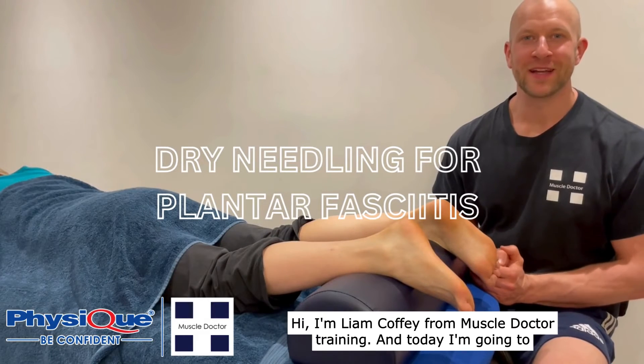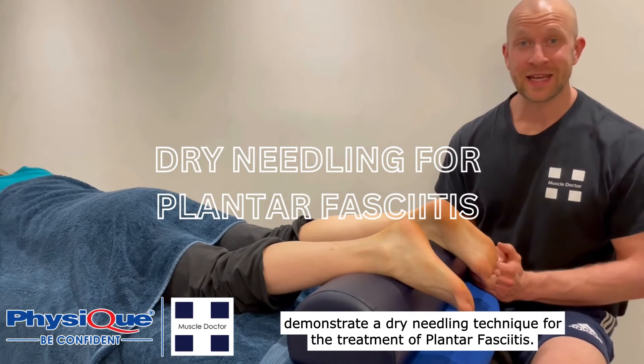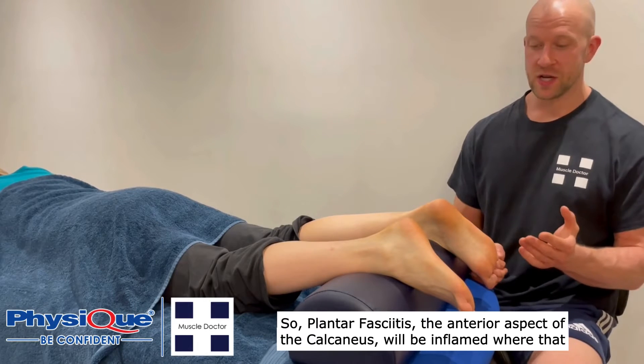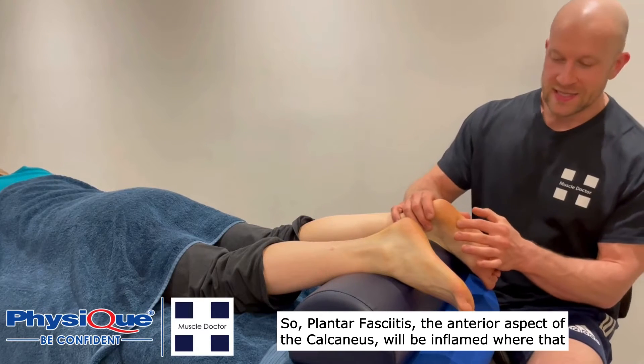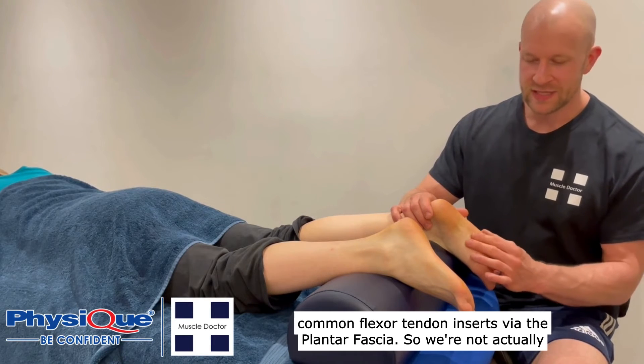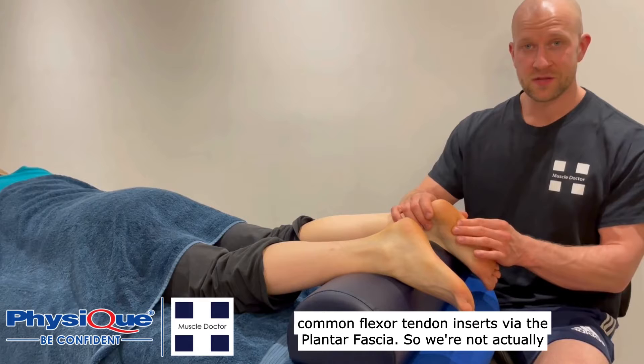Hi, I'm Liam Coffey from Muscle Doctor Training and today I'm going to demonstrate a dry needling technique for the treatment of plantar fasciitis. With plantar fasciitis, the anterior aspect of the calcaneus will be inflamed where that common flexor tendon inserts via the plantar fascia.